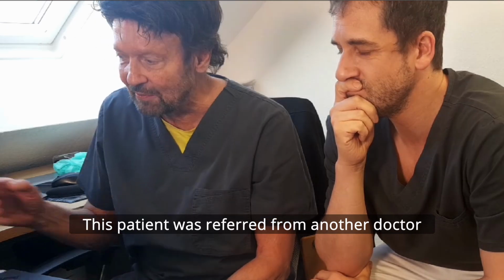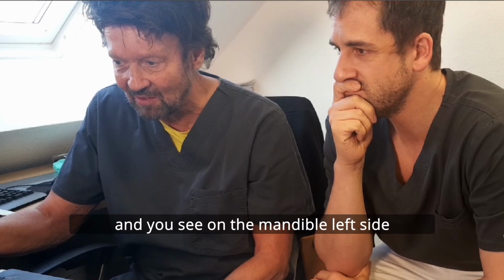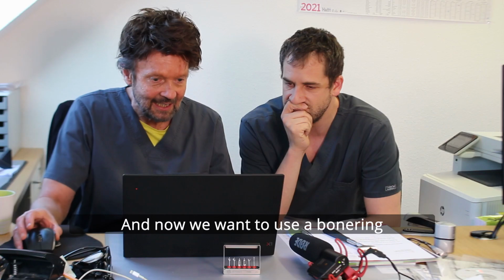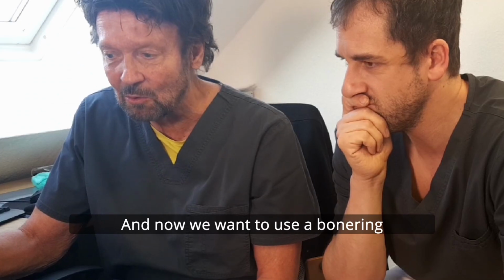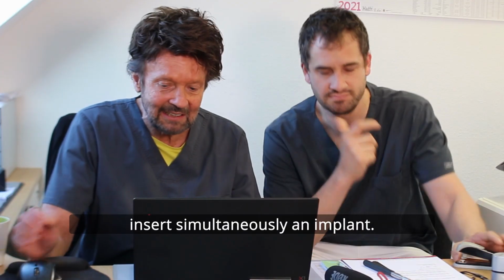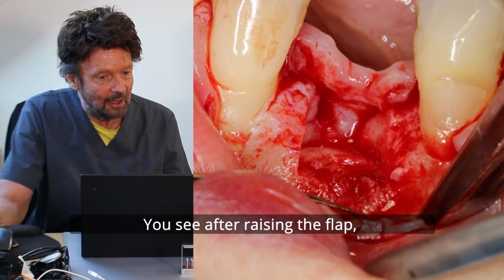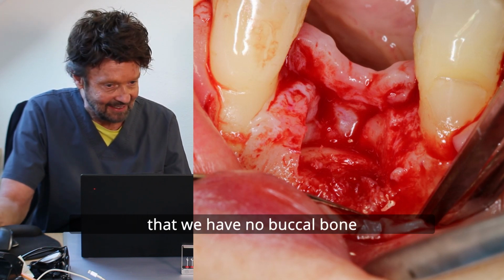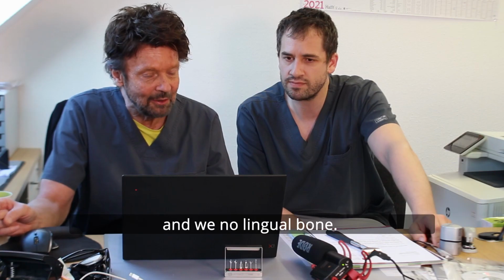This patient was referred from another doctor, and you see on the mandibular left side we have a huge defect. There was a big cyst, and now we want to use a bone ring technique to compensate this defect and to insert an implant simultaneously. You see, after raising the flap, the geometry of the defect is such that we have no buccal bone and we have no lingual bone.